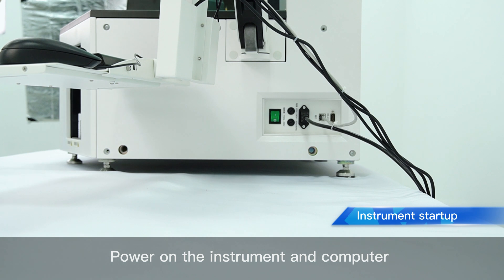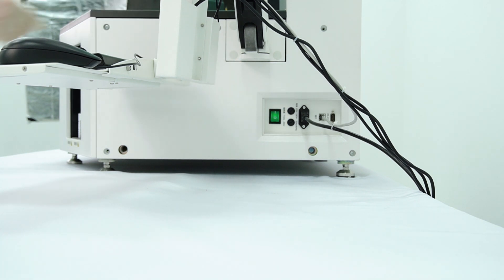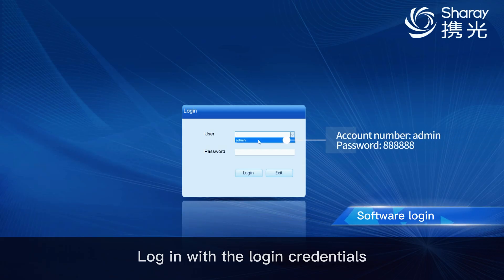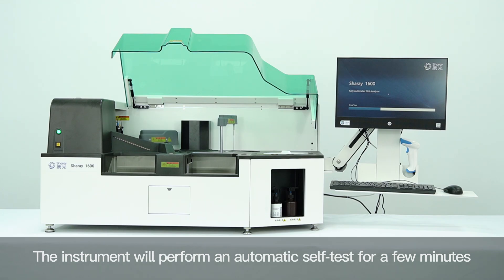Power on the instrument and computer. Log in with the login credentials. The instrument will perform an automatic self-test for a few minutes.